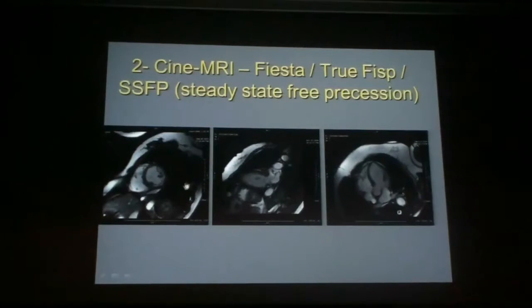But for people who don't want to contour the endocardial border of your left ventricle, because it takes time, a very easy way to analyze quickly, to have a good idea of this ejection fraction, is to look at the thickening of the anterior wall, of the inferior wall of the left ventricle, of the septum, and of the lateral wall. So on these two views, if you give 15% to each of these walls, in terms of quantity of thickening, then at the end you do get 60%.